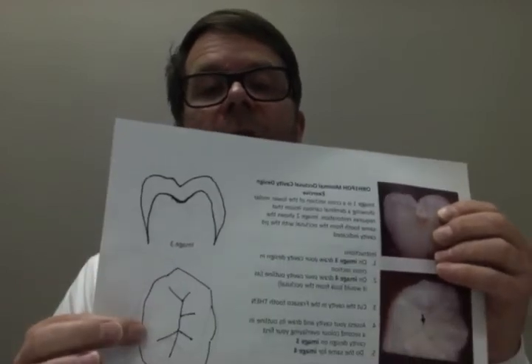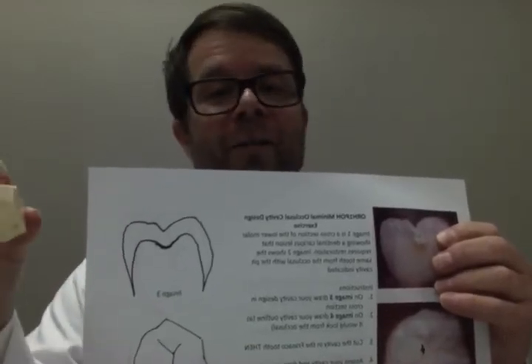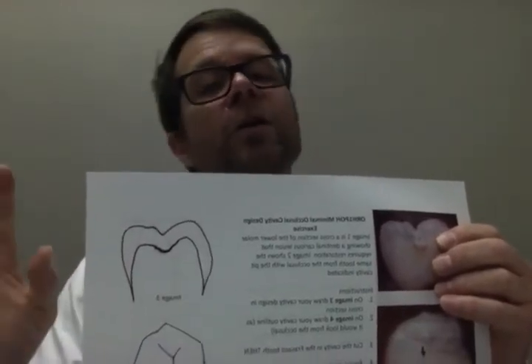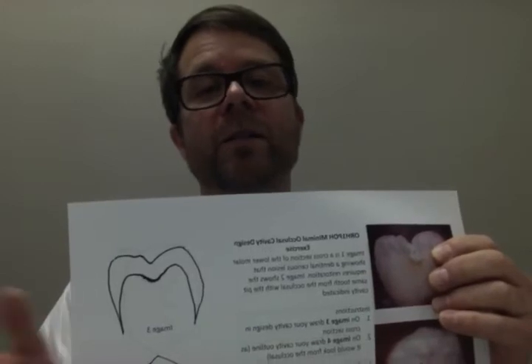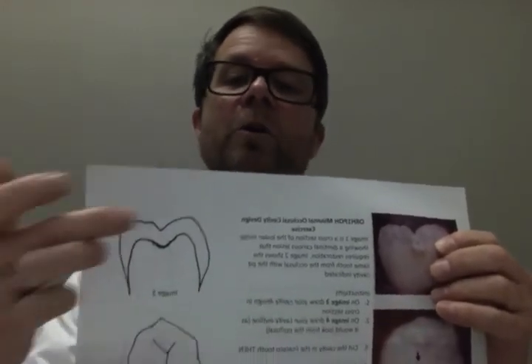and then coming back to your worksheet, on the same line drawing where you drew your ideal cavity preparation, draw in the outline of the cavity that you actually produced and then compare that with the ideal outline. Talk to your teacher about the difference between what you were able to produce on your model and what you know is the ideal outline.